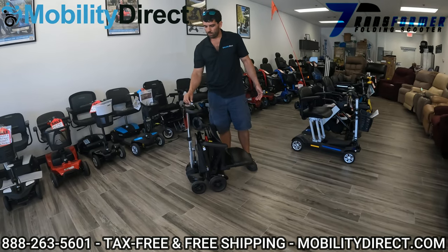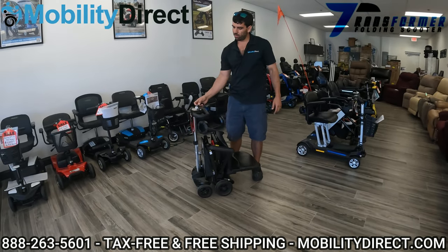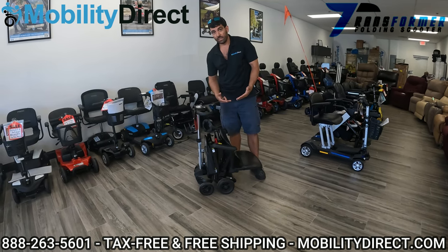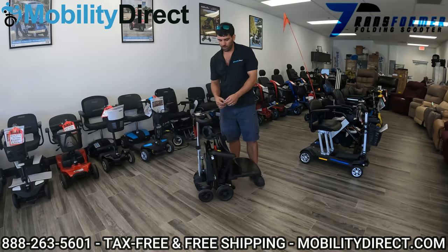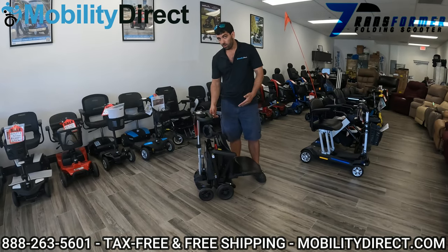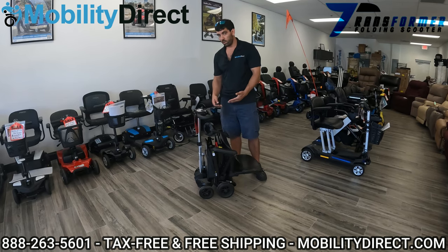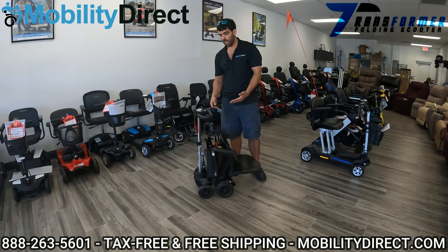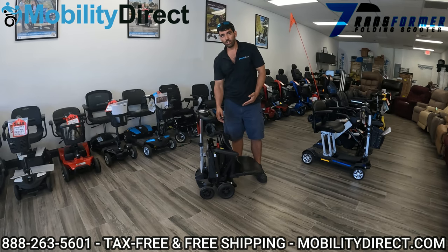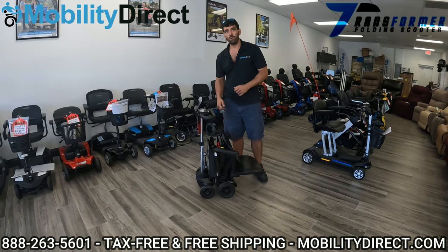So what does that mean? Well, now that the scooter is manually folded, the actual motor that is used to fold it thinks that it's in the unfolded position. So if I go to try and fold it, the motor to fold it is actually doing its job, but that red lever that we engaged unhooked it from the folding motor.